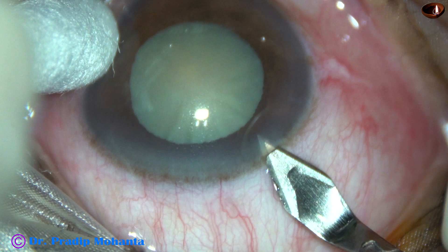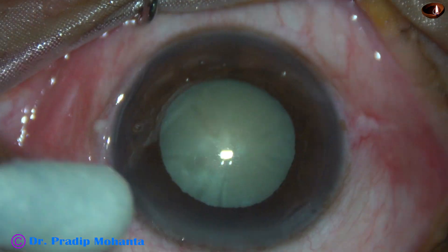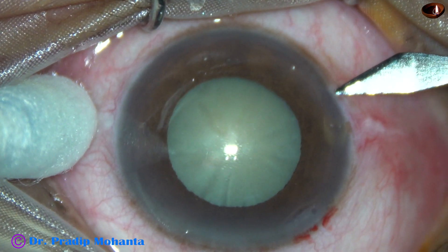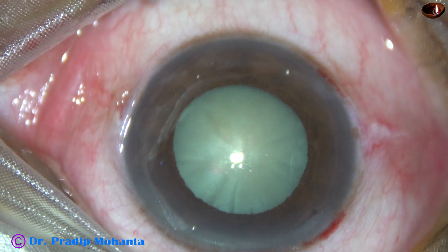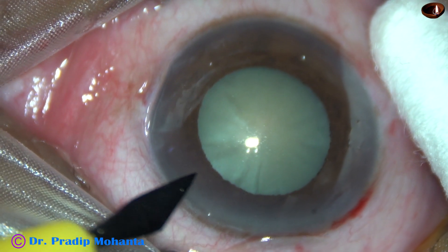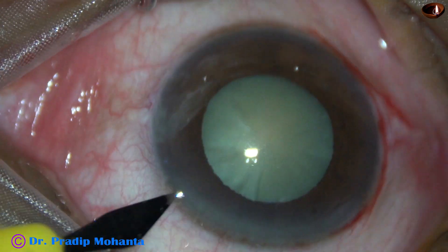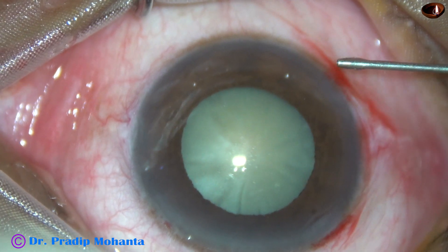This is the main incision with a 2.8 mm steel keratome on the posterior aspect of the limbus at around 135 degree axis. This is a side port on the right side of the main incision about 3 o'clock hours away, and this is another side port on the left side of the main incision about the same distance away.